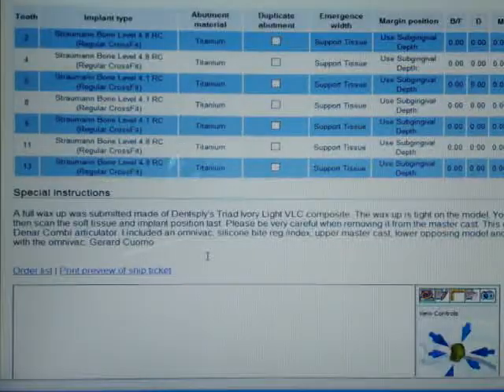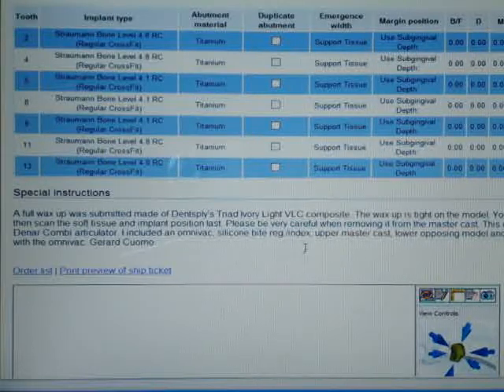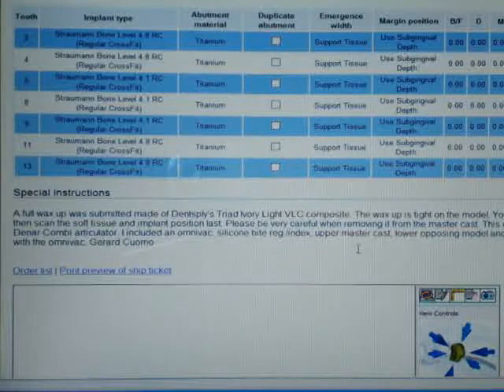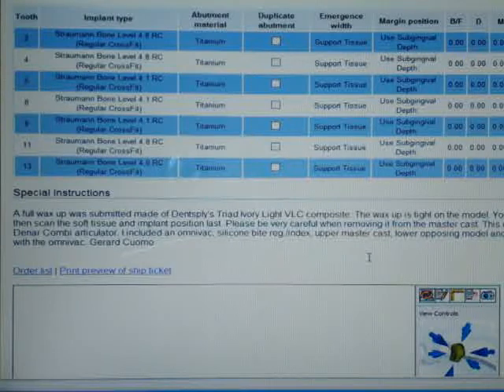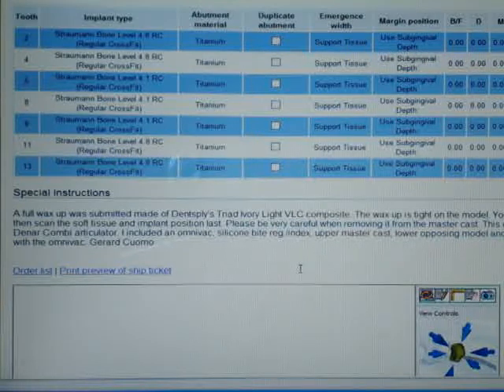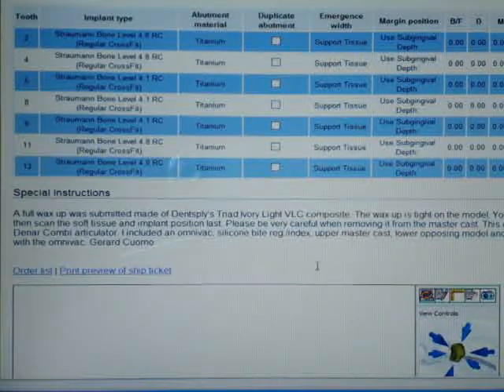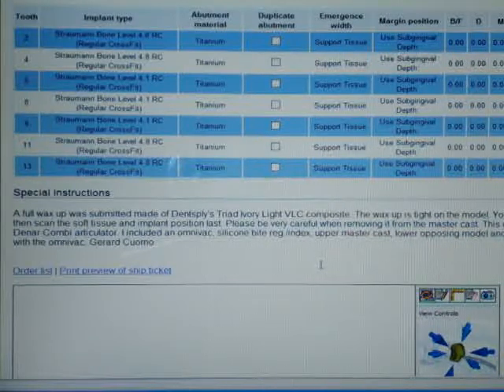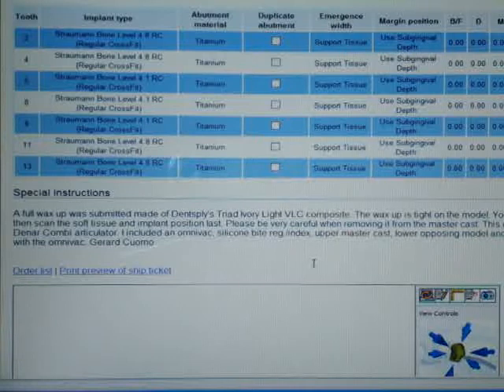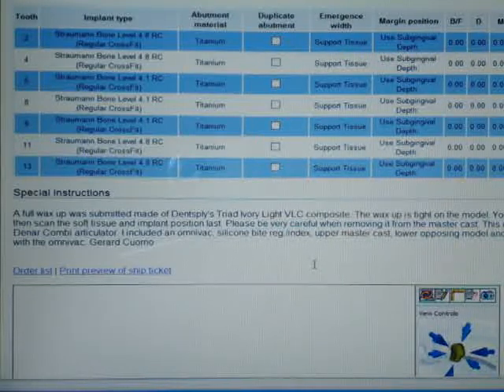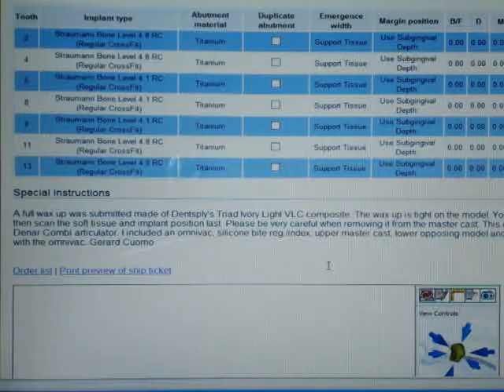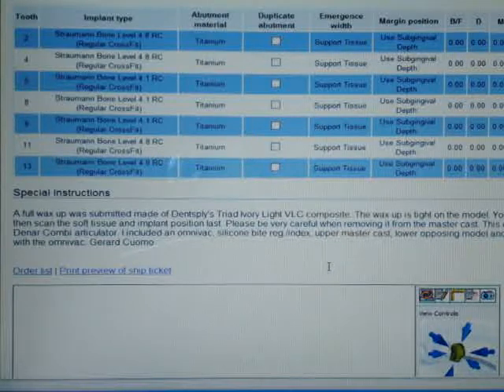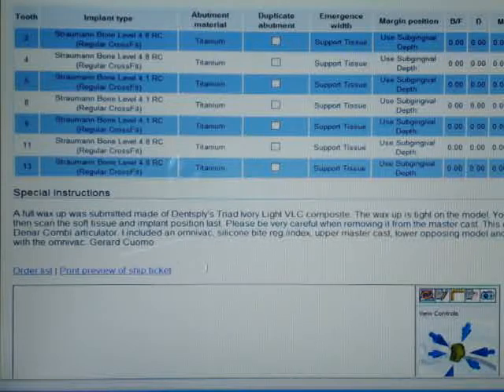I said a full wax up was submitted made of Dentsply's Triad Ivory Light Cure composite. The wax up is tight on the model. You may want to scan the wax up first and then scan the soft tissue and implant position last. Please be very careful when removing it from the master cast. This case was mounted using magnets on a Denar Combi articulator. I included an OmniVac silicone bite registration index, upper master cast, lower opposing model, and a palatal silicone index positioner used with the OmniVac. And then I just put my name.